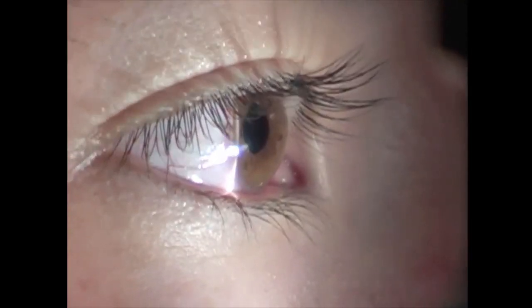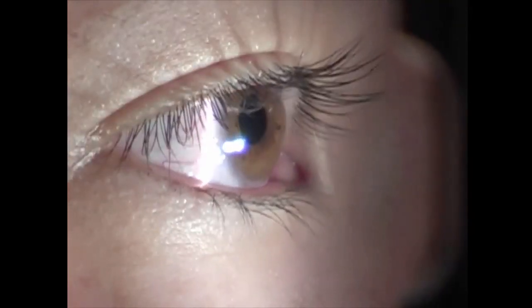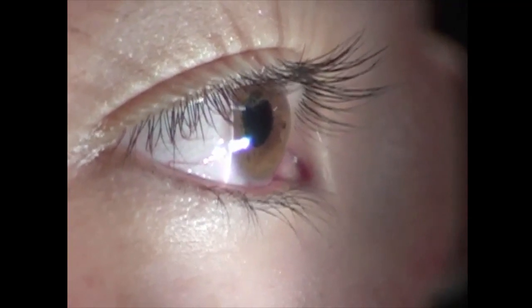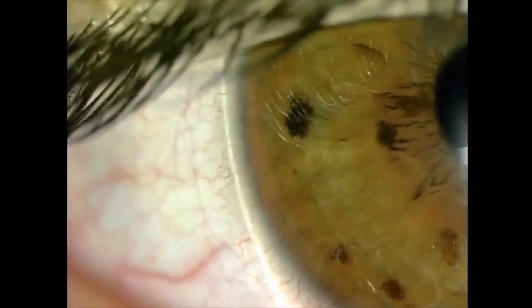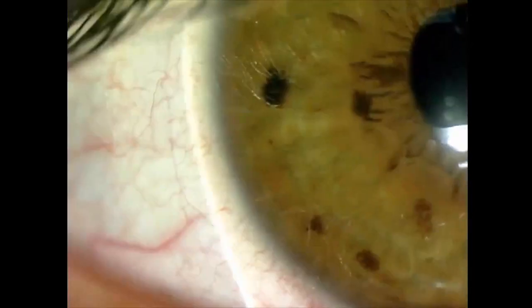So we're coming in a dark room with a very thin beam of light coming from the temporal side. And I show this because I've had people describe that they're doing the Van Herick over the pupil. That is not correct. So I bring the beam in until I just barely find the anterior chamber, like that.